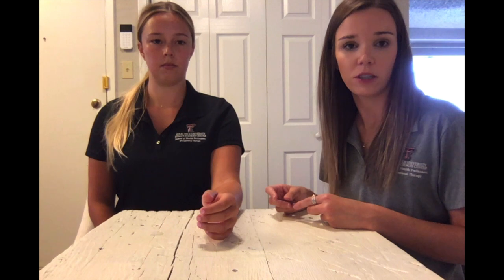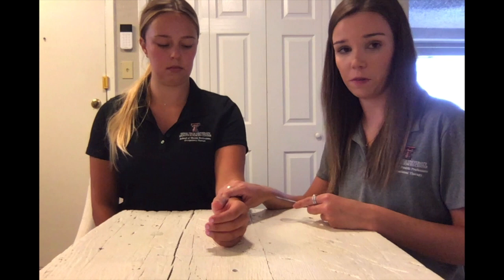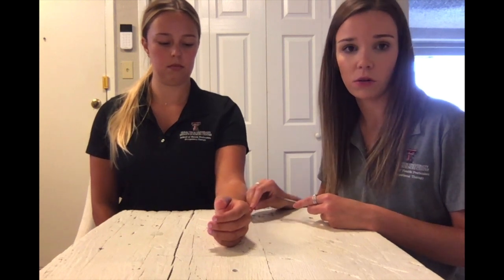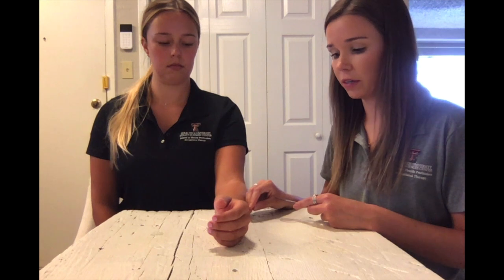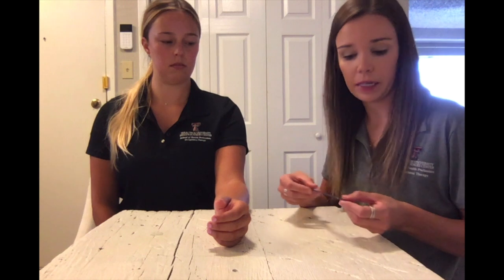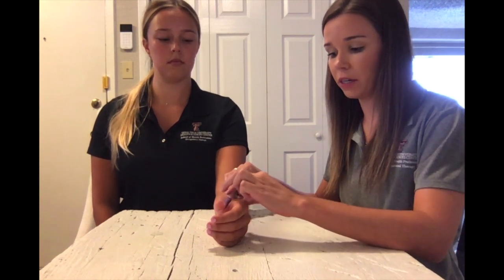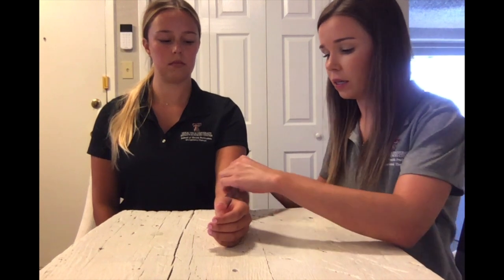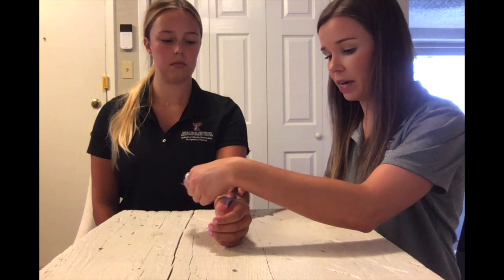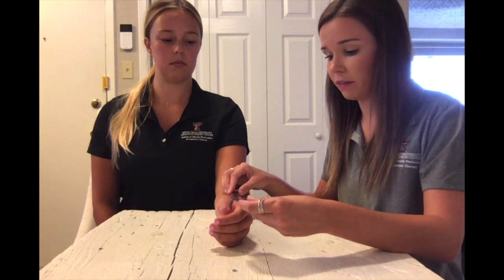To measure flexion and extension of the wrist, your client will be positioned seated at a table with their feet flat on the floor and good posture. Their forearm will be resting on the ulnar border on the table surface and their fingers will be relaxed. To measure wrist flexion, you're going to place the axis of the goniometer just distal to the radial styloid over the anatomical snuff box. The stationary arm will remain in line with the radius and the moving arm will follow the metacarpal of the index finger.